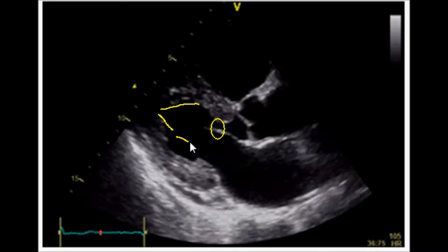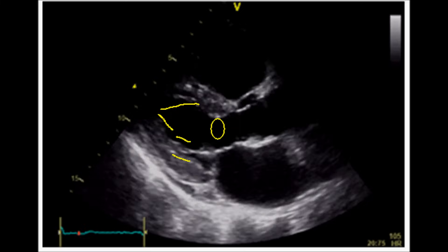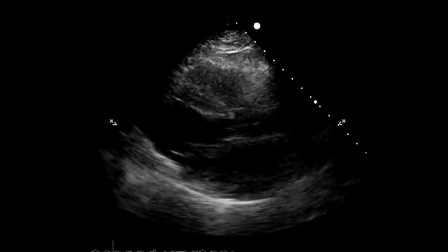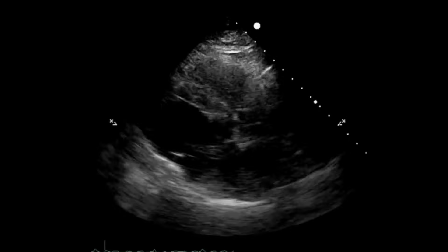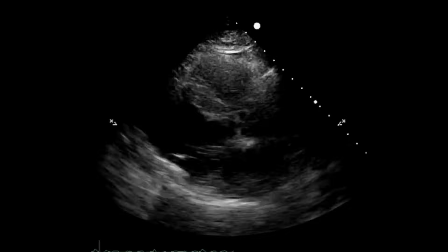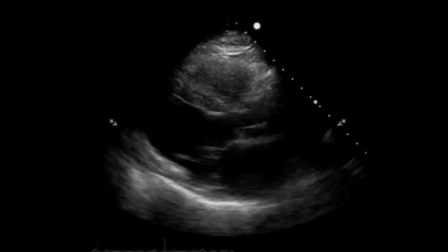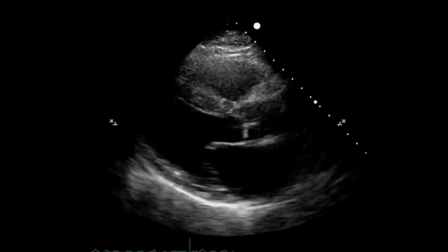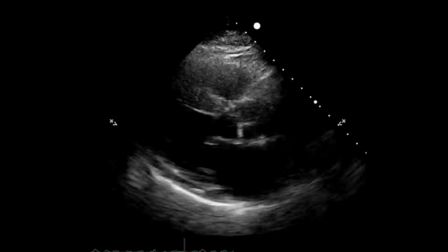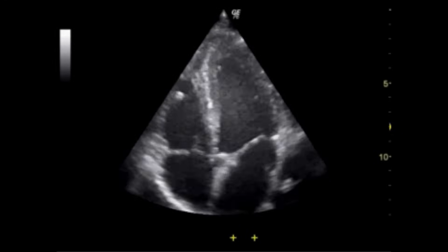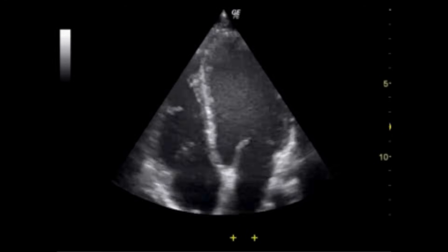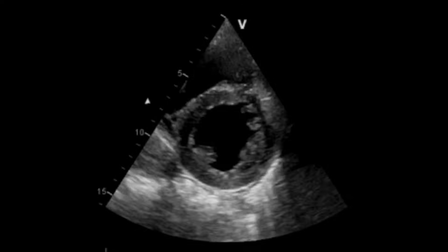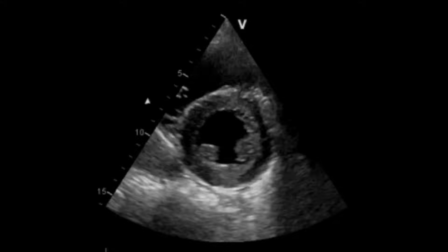The third characteristic is reduction of the left ventricular cavity, also called fractional shortening. The left ventricle lumen should contract by greater than 25 to 40%. In a heart with decreased ejection fraction, the mitral valve leaflet motion is much less pronounced, the anterior leaflet does not reach as close to the interventricular septum — increasing the e-point septal separation — the cavity contracts much less, resulting in less fractional shortening, and the myocardium does not thicken to the same degree. In the other two views, we focus more on myocardial thickening and fractional shortening.